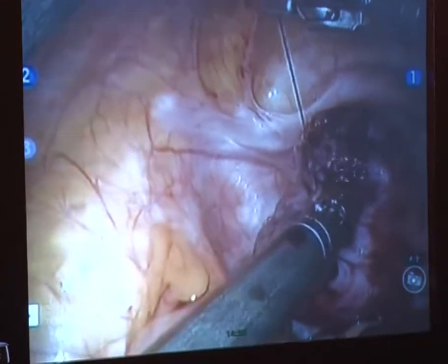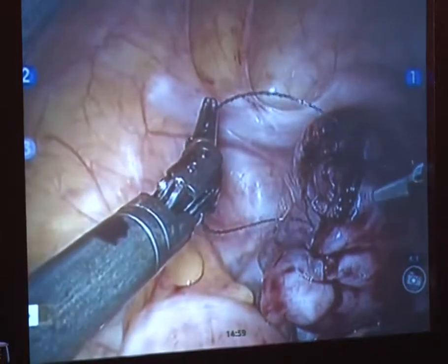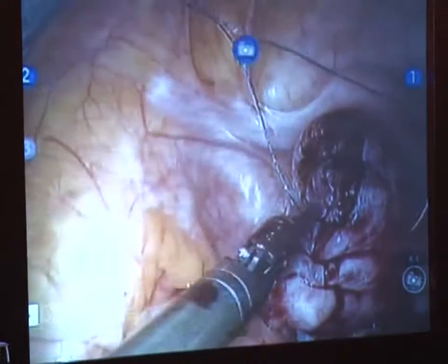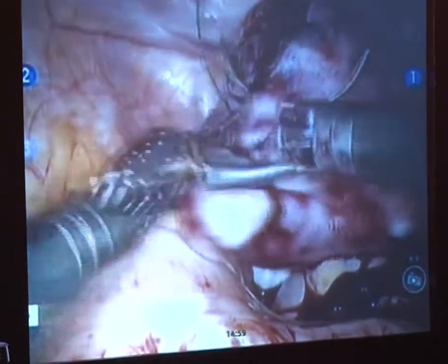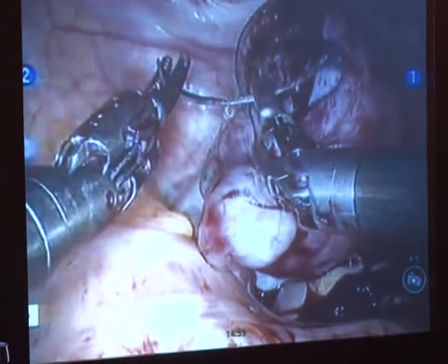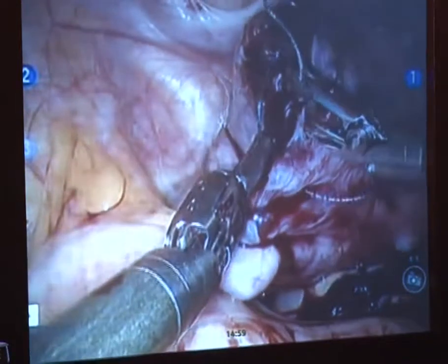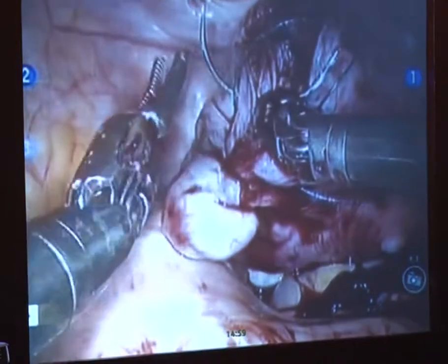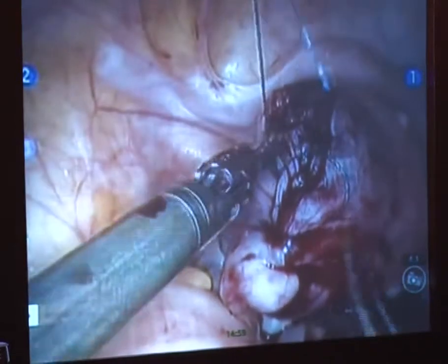Arnie, do you use baseball stitches on the serosa, or do you just use continuous? You know, I used to do baseball stitches a long time ago when I sewed with Vicryl and Monocryl, and it looks aesthetically pretty. At the end of the day, I don't know if it makes a heck of a lot of difference. So I stopped doing it, because it's just a time sucker. I don't think it adds any additional value. Whether I did a baseball stitch or not, I always put an adhesion barrier down, so I just don't know whether that's really adding to the procedure. I mean, it looks nice. You can do a baseball stitch with barbed suture.